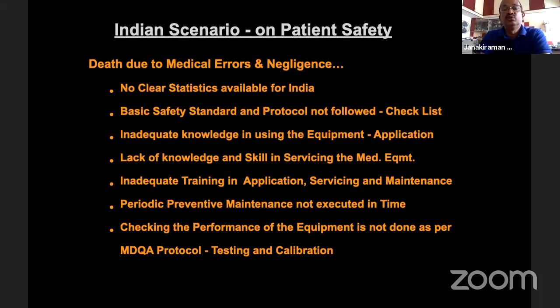Inadequate knowledge in using the medical equipment. People do not know the total application of an equipment. Lack of knowledge and skill in servicing the medical equipment, which comes under biomedical engineering. Inadequate training in application for the doctors, the service providers, and the service engineers, and in how to maintain an equipment and what the frequency of maintenance should be. Periodic preventive maintenance programs are not executed in time. This is the major concern in all our hospitals in India. We always wait for an equipment to fail. When the machine fails, we call the service engineer.